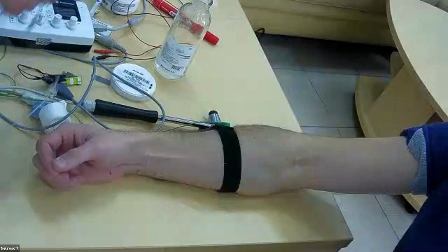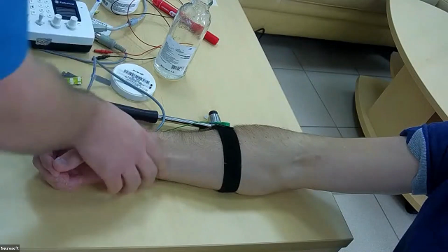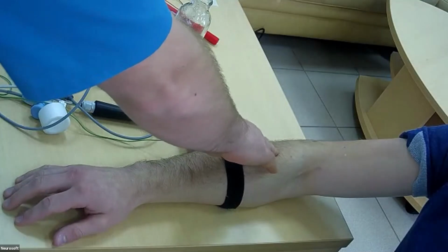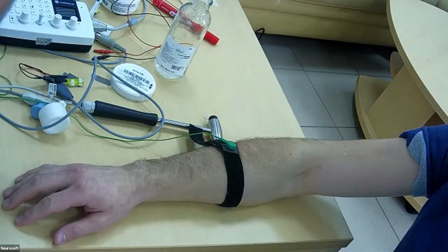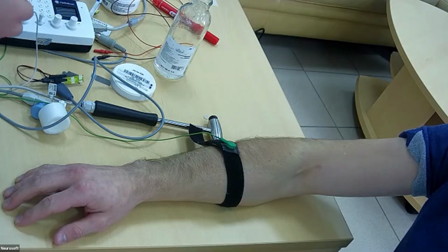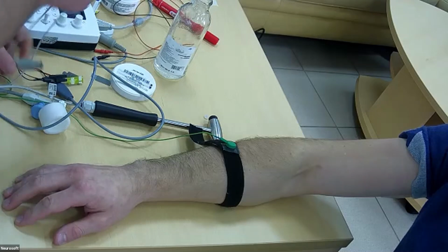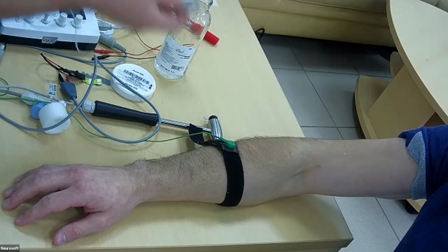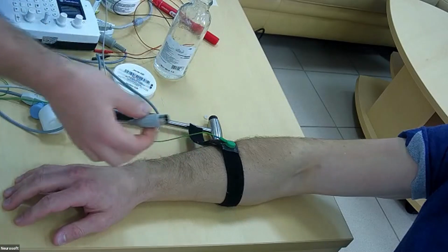We will use jitter first. We will use the extensor digitorum muscle. We insert the connector for the needle.